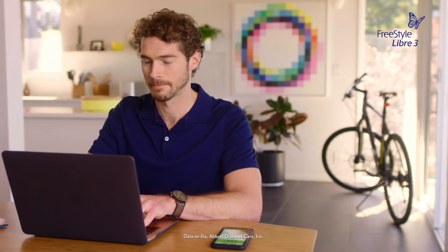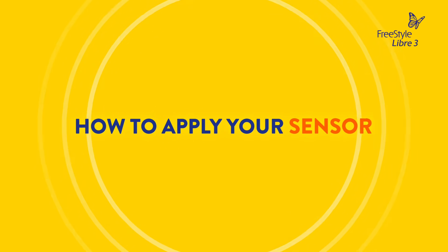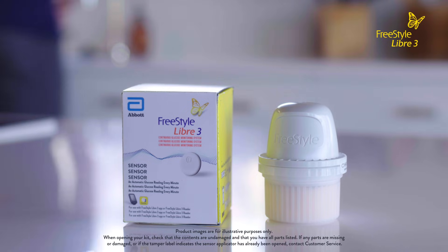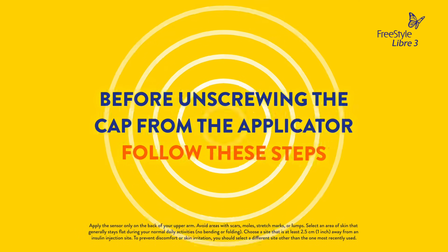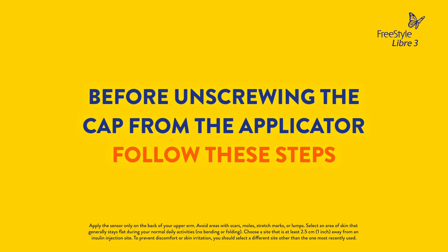Applying a sensor is easy. Your Freestyle Libre 3 sensor kit includes a product insert and a sensor applicator, which you will use to apply the sensor to the back of your upper arm. Before unscrewing the cap from the sensor applicator, follow these steps to prepare the back of the upper arm.